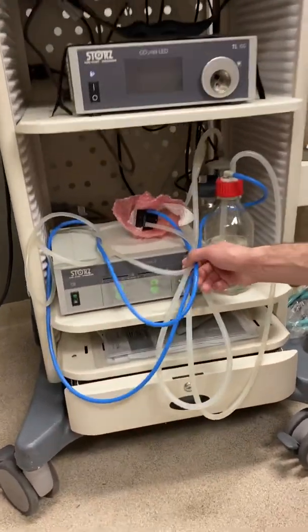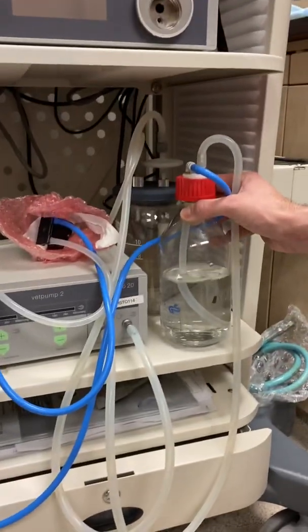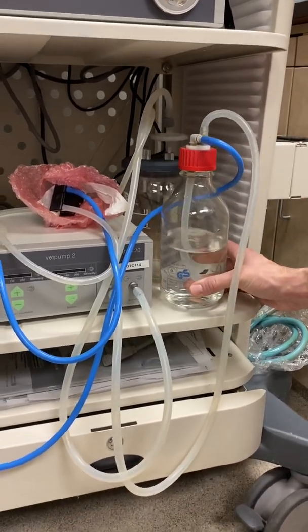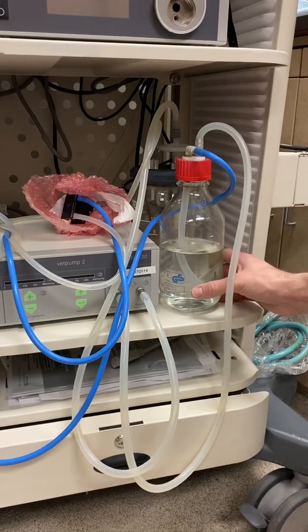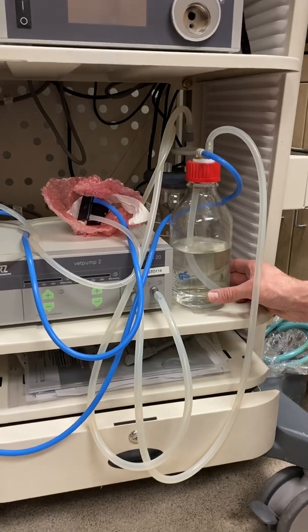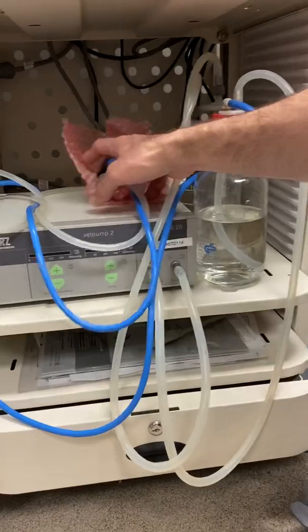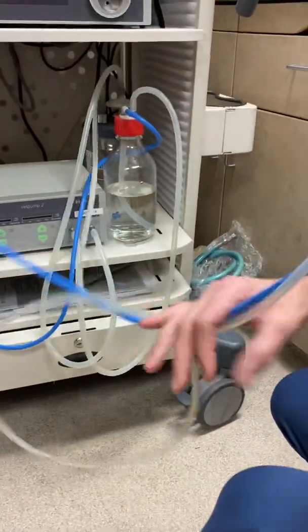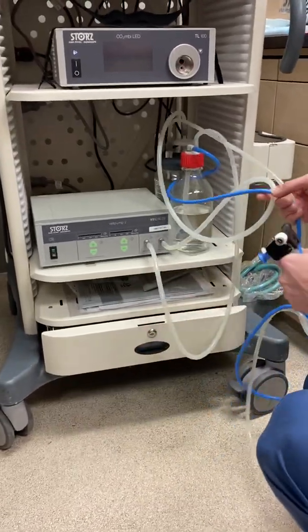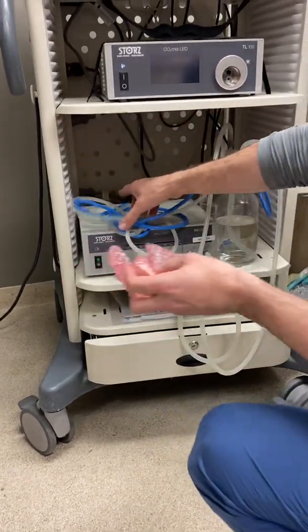The bottom unit here is called the VET Pump 2, which is a suction and irrigation unit. You can see the distilled water over here and there's a suction bottle behind it. This is used mainly with derm, suction, flushing, and cleaning the ears, but it can be used in LAP and other units as well. There's a handle and a bunch of tubes as part of it.